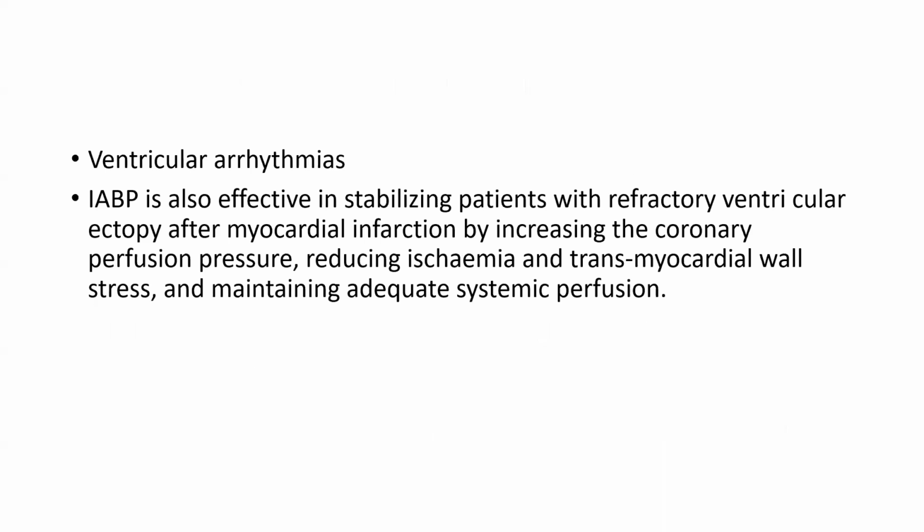Now, regarding ventricular arrhythmia, IABP is also effective in stabilizing patients with refractory ventricular ectopy after myocardial infarction by increasing coronary perfusion pressure, reducing ischemia and transmyocardial wall stress, and maintaining adequate systemic perfusion.